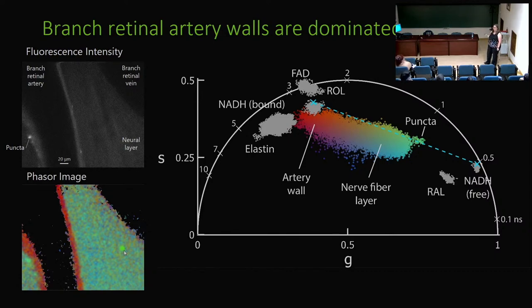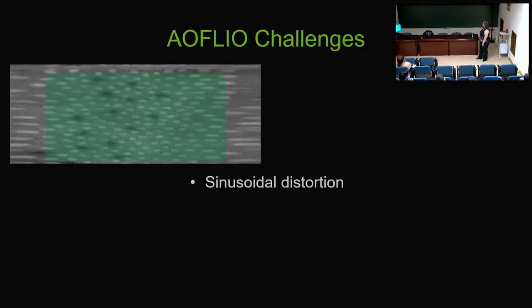Monkeys are very difficult to work with. We get few of them. There's not a lot of disease models in the monkeys. And so in moving to Waterloo, we're shifting all of this work to be done in mice so that we can start looking at mouse models of retinal degeneration, mouse models of outer retinal degeneration, glaucoma models, various things to look in the inner retina there.